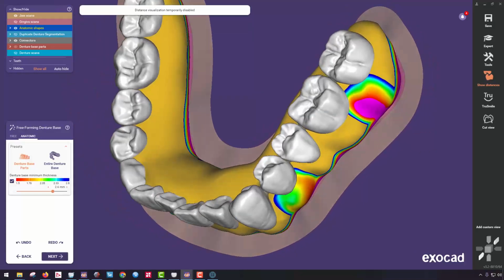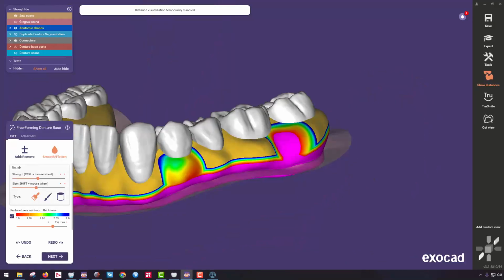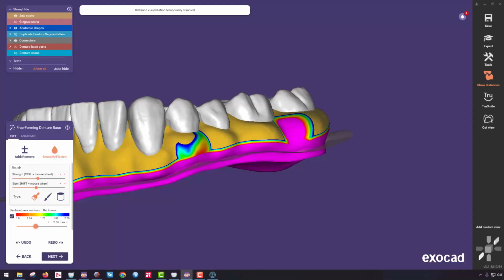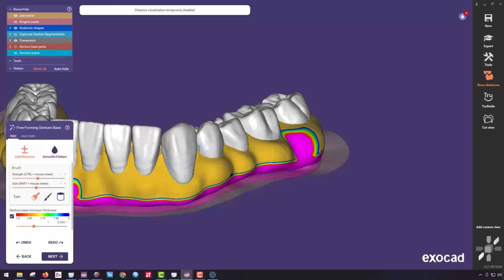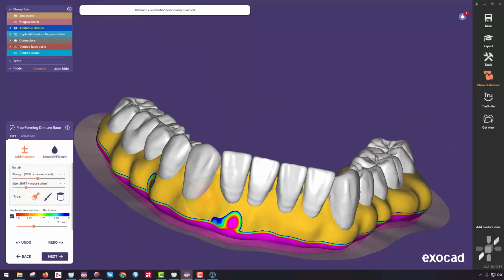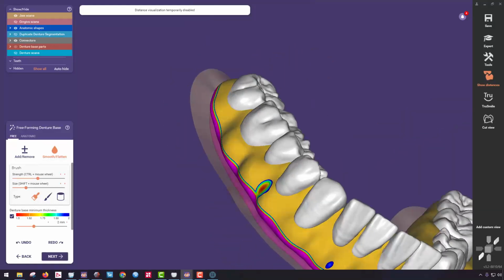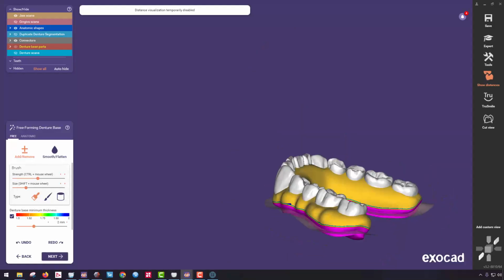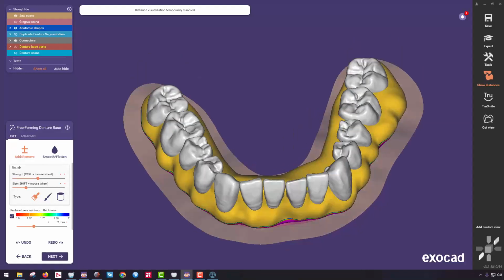Now, usually if it's a copy denture function, I don't want to do too much here, but if you wanted to smooth it out just a little bit, like it's a little bit rough, or maybe I wanted to make sure that I've got 2 millimeters of thickness, I can set this number to 2, and then it will tell me, oh gosh, you don't have 2 millimeters of thickness. Let me just thicken that up to get to 2 millimeters right here, everybody. It's a good safety gap and measure to make sure that you've got 2 millimeters of thickness. If you're going to follow the Zest white paper guidelines, I want to make sure that I have the proper thickness of my prosthesis to ensure strength of my zirconia, my PMMA prosthesis, etc. And it doesn't really change the aesthetics that much of my restoration.